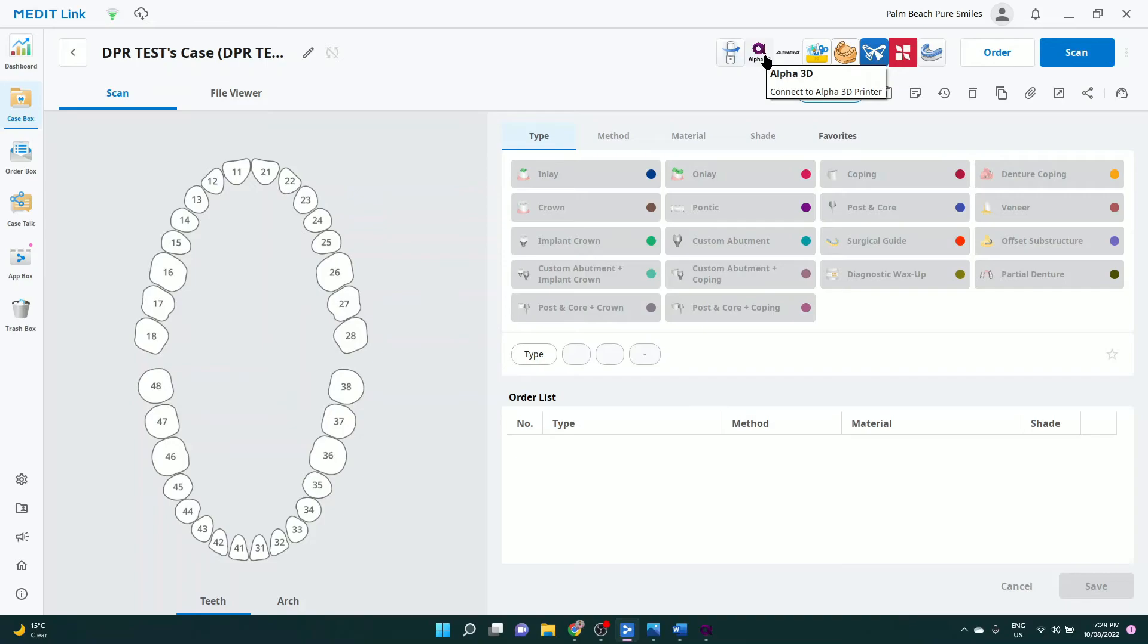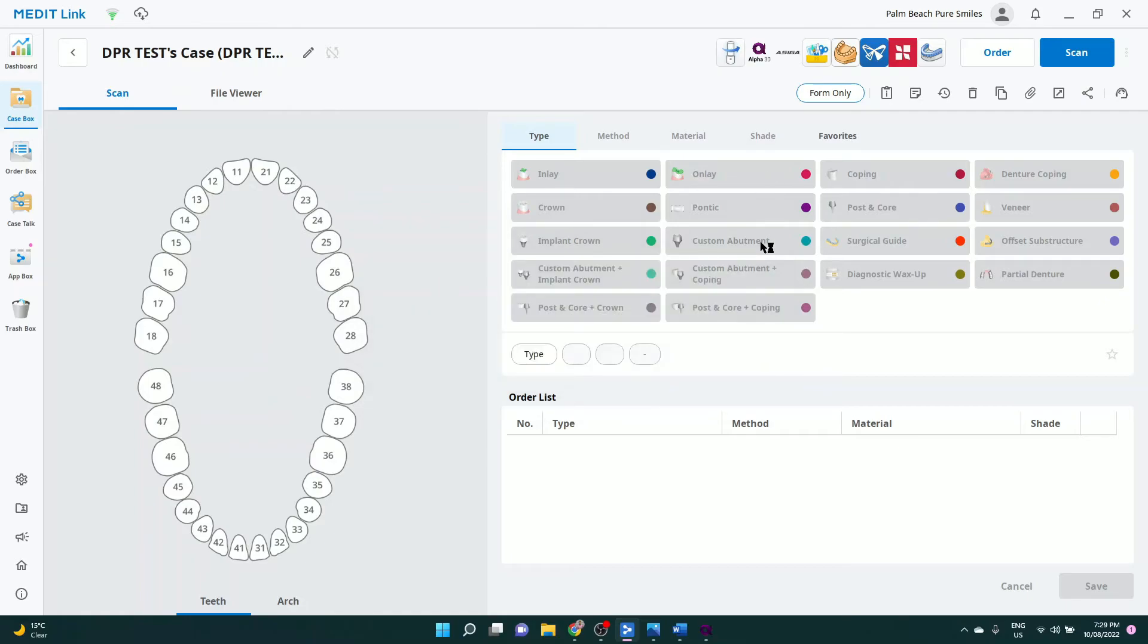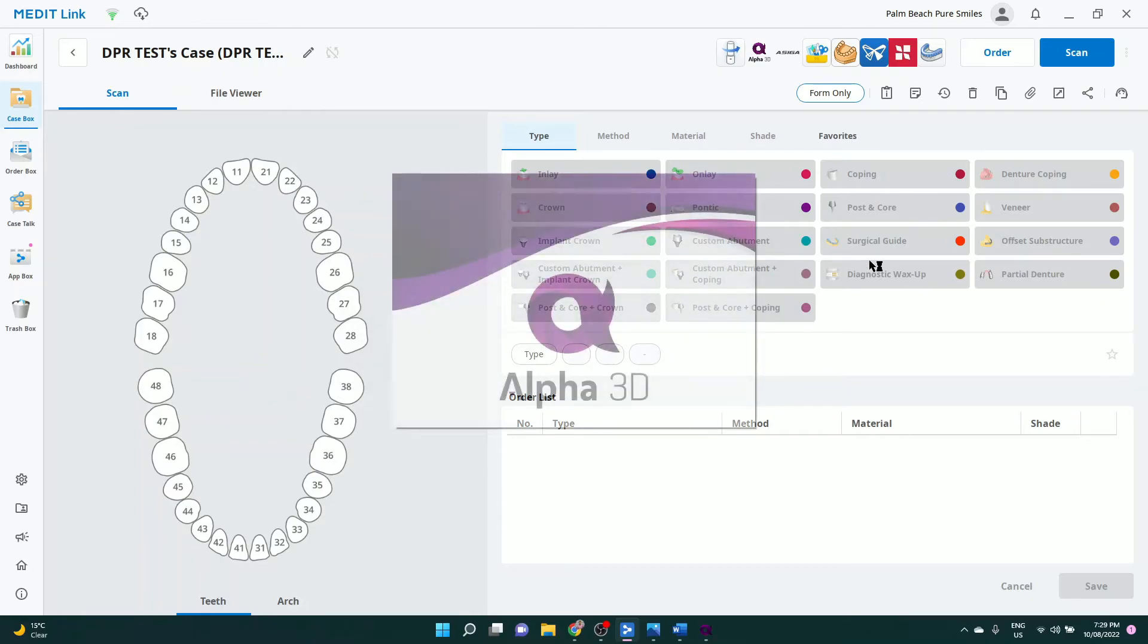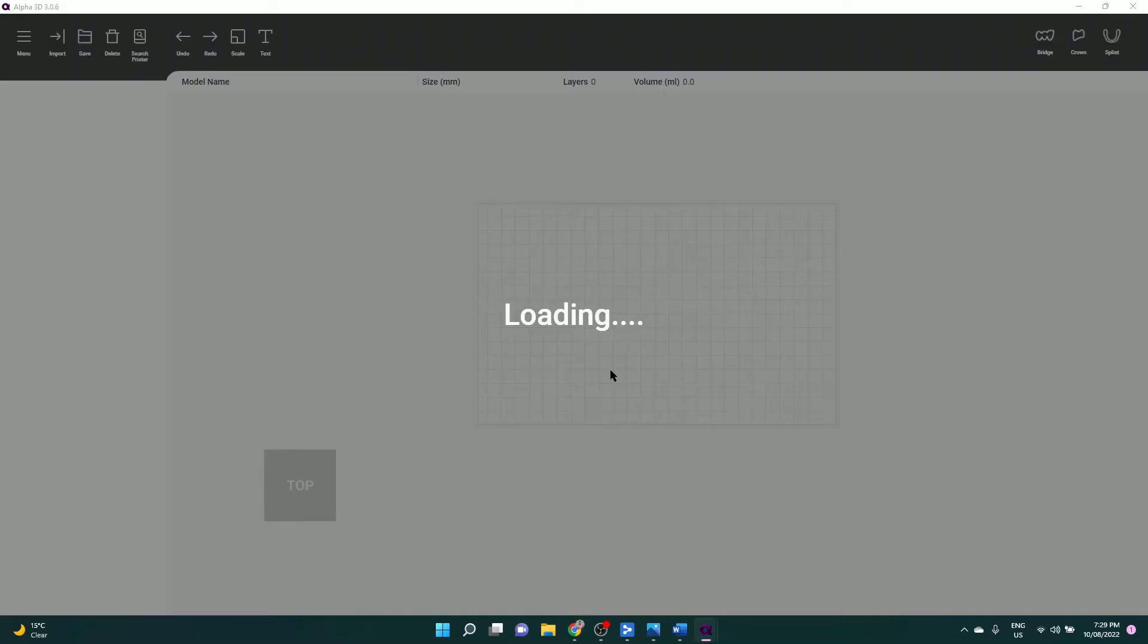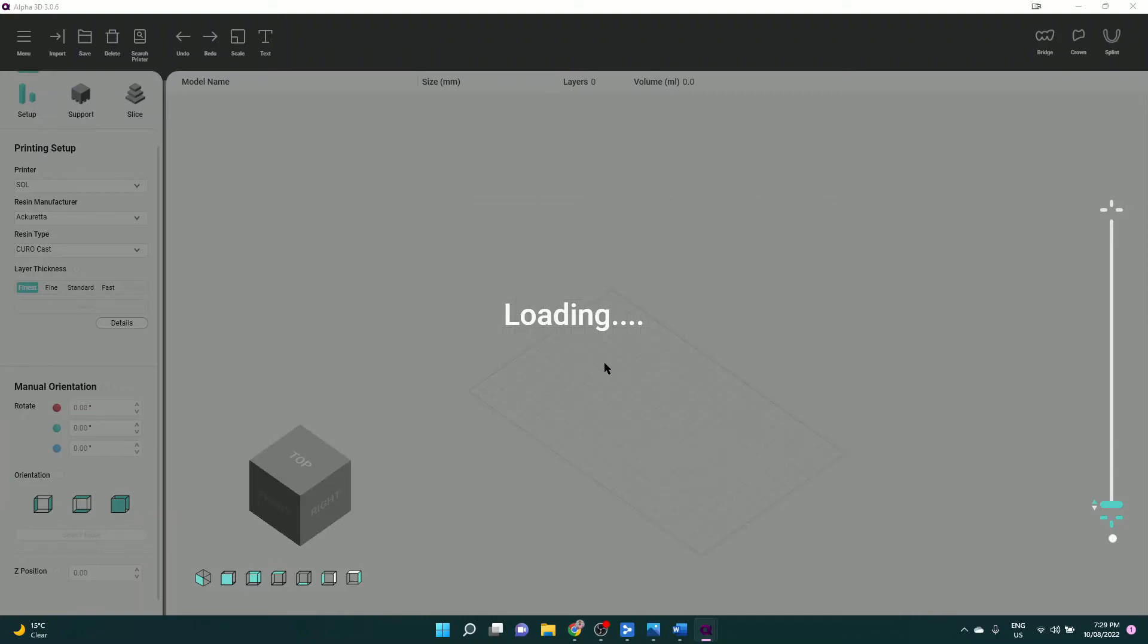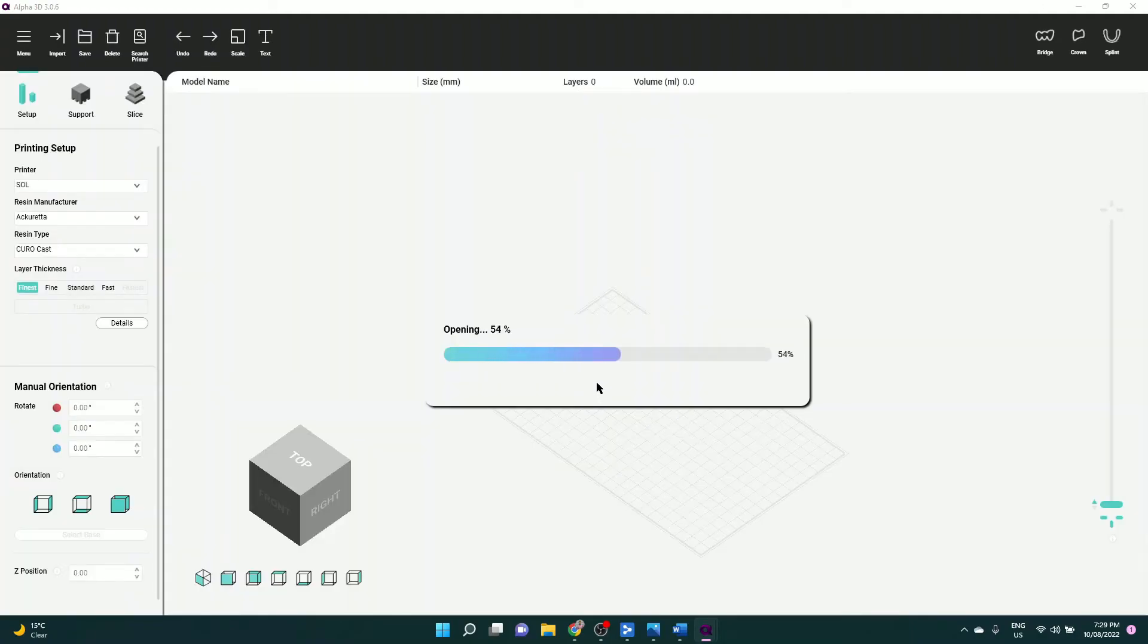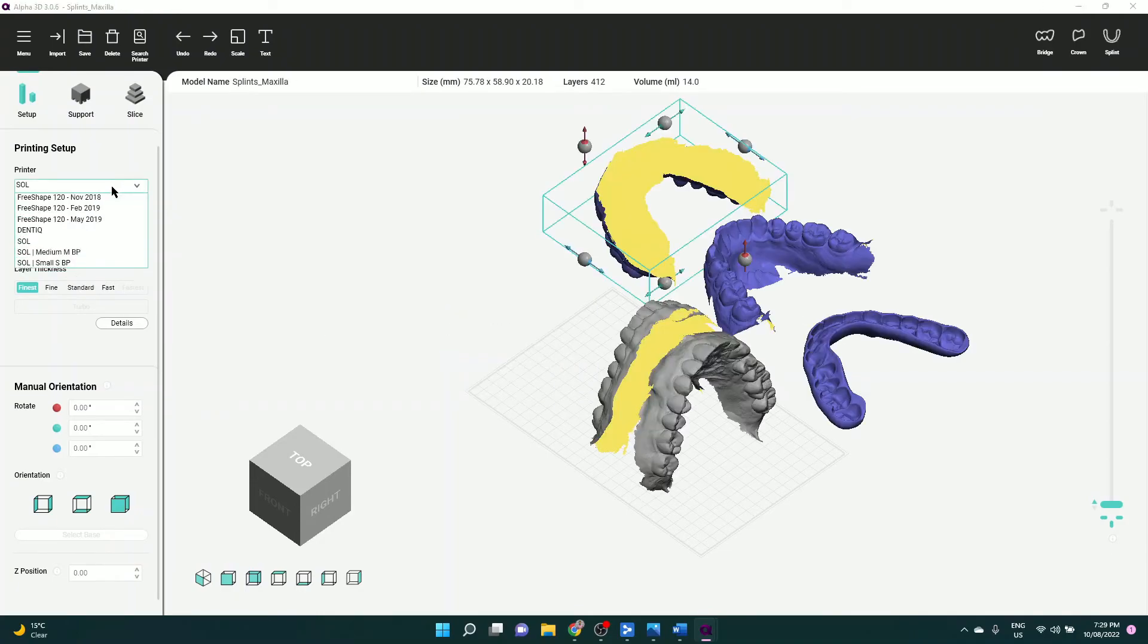Another good thing about Medit Link is all the different integrations to your printers. So from here, one button, it'll take me into my printer software. You'll see all the files get loaded in, including the scan of the upper and lower arches. You just delete the ones you don't need, and the one that remains will be the one that you want to print.